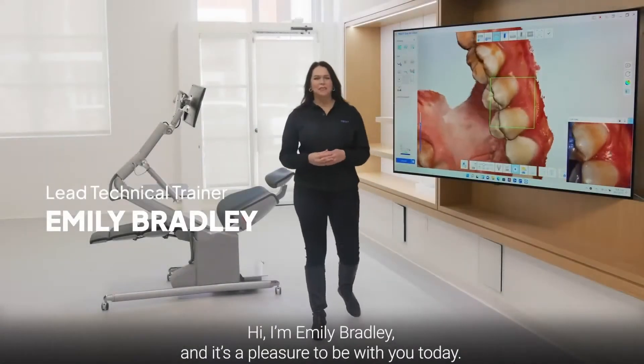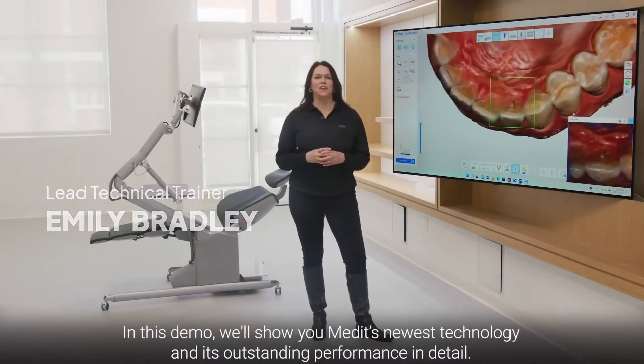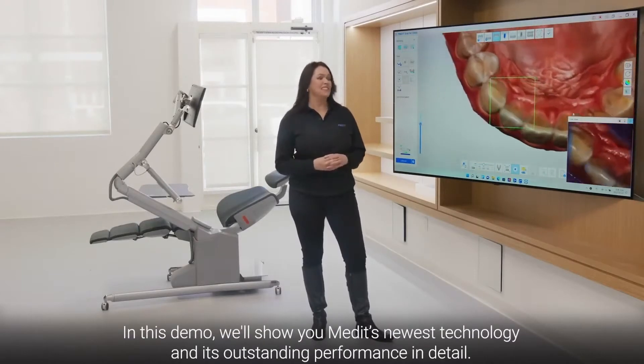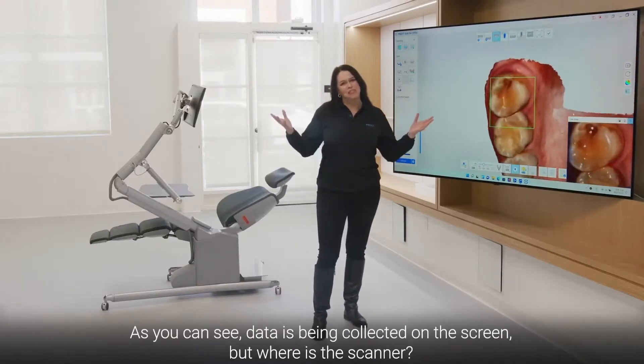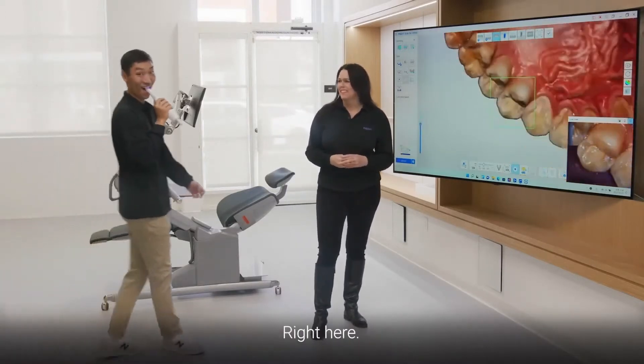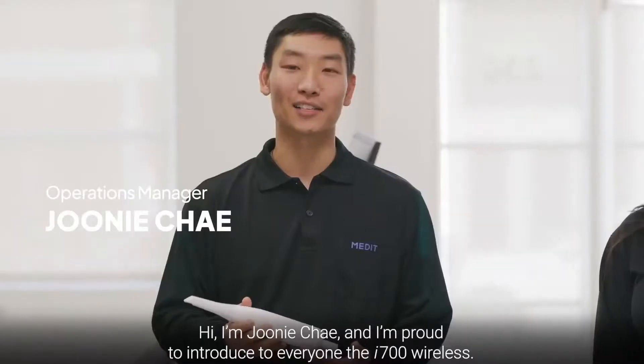Hi, I'm Emily Bradley, and it's a pleasure to be with you today. In this demo, we'll show you Medit's newest technology and its outstanding performance in detail. As you can see, data is being collected on the screen, but where's the scanner? Right here. I'm Juni Che, and I'm proud to introduce to everyone the i700W.